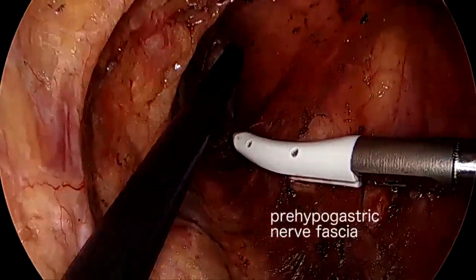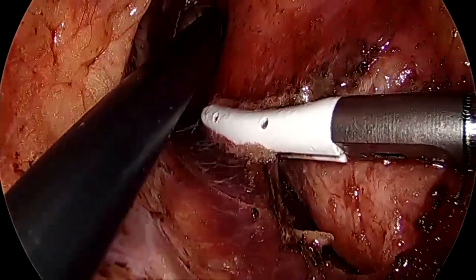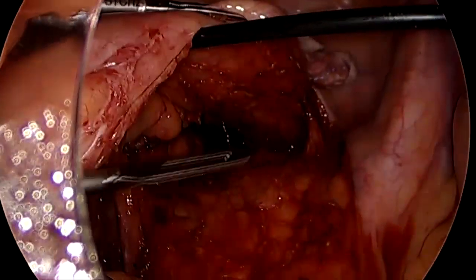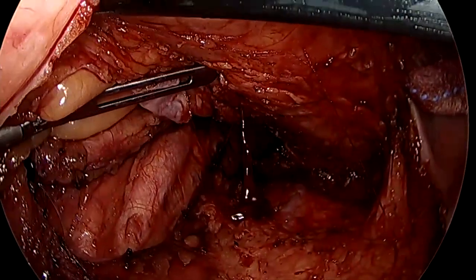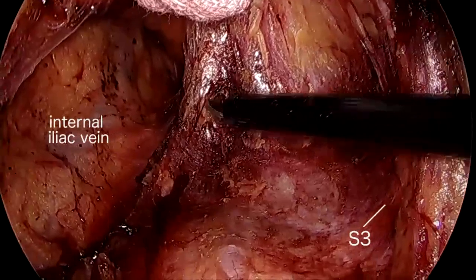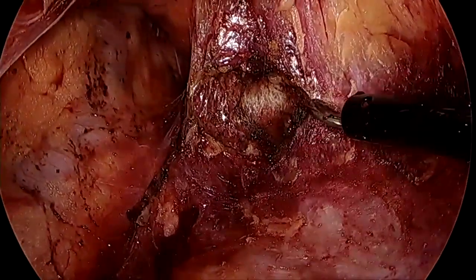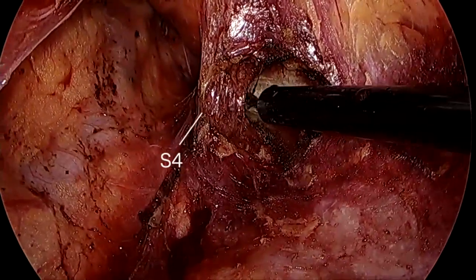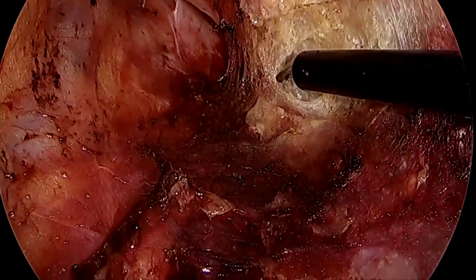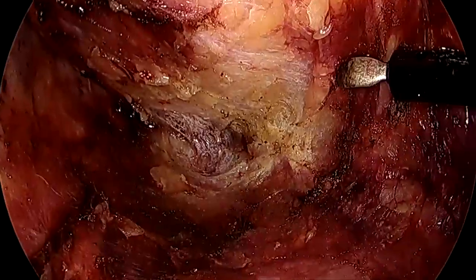The pre-hypogastric nerve fascia was divided. After lifting up the rectum, the S3 and S4 pelvic splanchnic nerves on the left side were divided. On the right side, the S3 and S4 nerves were preserved.